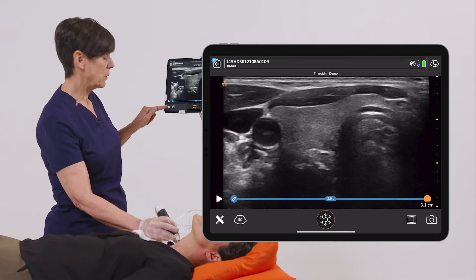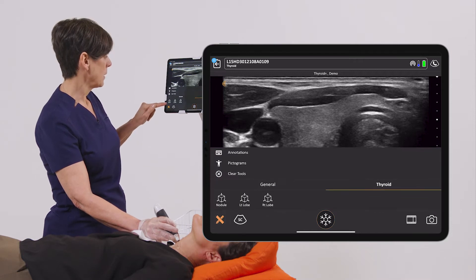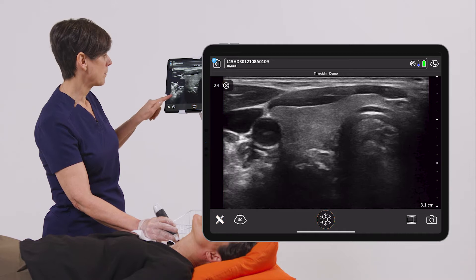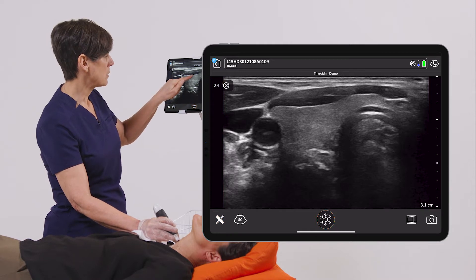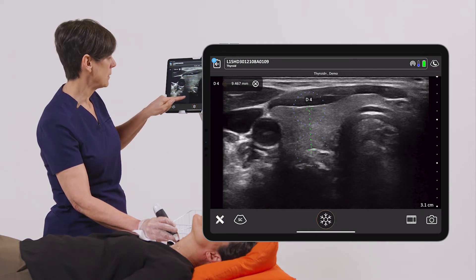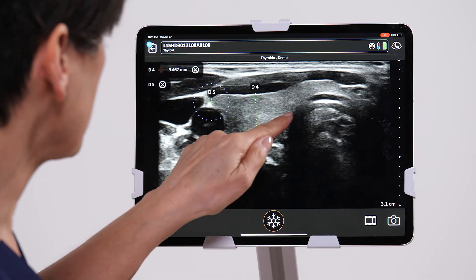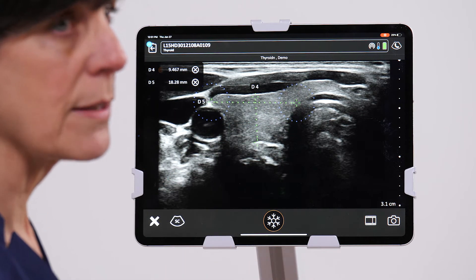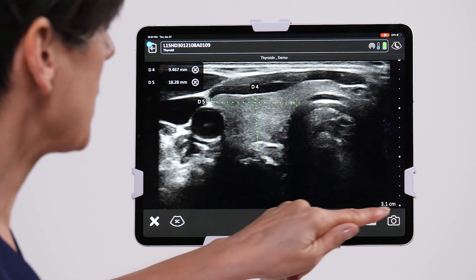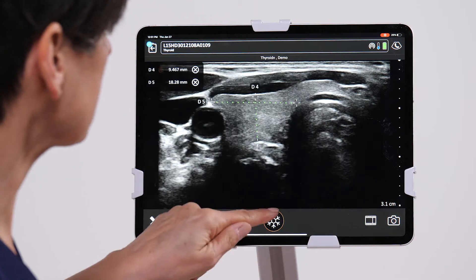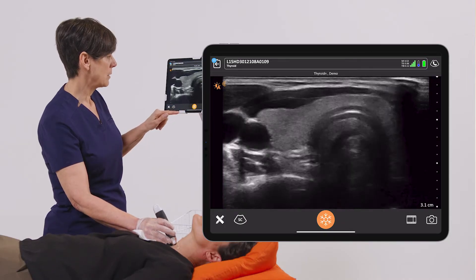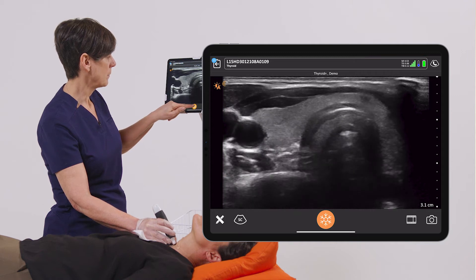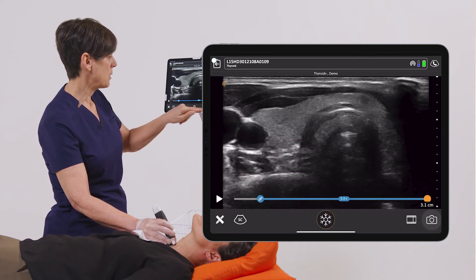If I go into the measurement icon, I'm going to do a general distance measurement. I'm going to measure the AP diameter as well as the transverse diameter — this will give us a good indication if anything is enlarged. We'll take a picture, and next I'll head down to the lower pole of the right lobe of the thyroid and take an image of that.